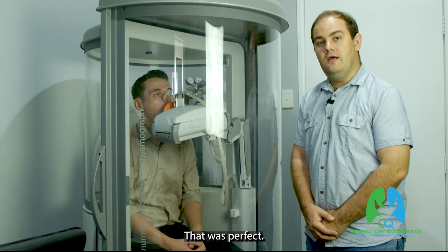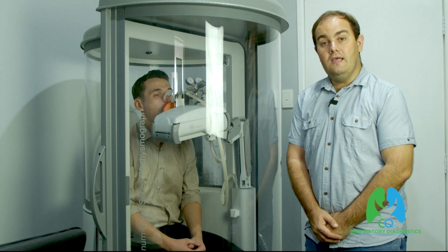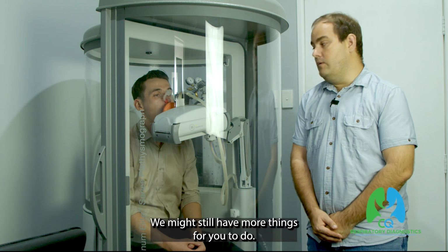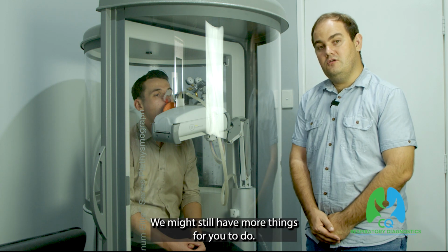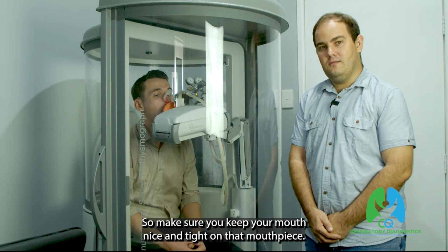That was perfect. Remember not to come off the mouthpiece at the end of the test. Even if you think you're done, we might still have more things for you to do. So make sure you keep your mouth nice and tight on that mouthpiece. Thank you.